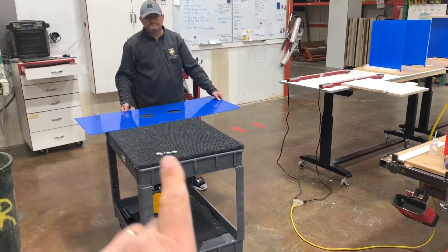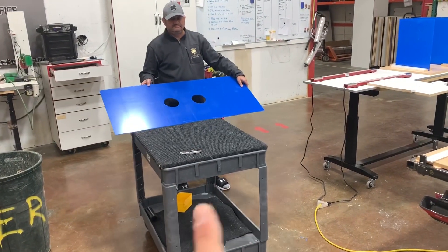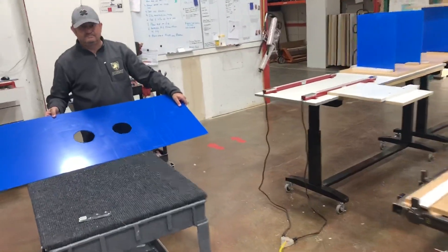Derek here with The Closet Doctor. We've been working this morning on the intubation shield setup, and we've got a production line setup. First, we're running parts on the CNC.